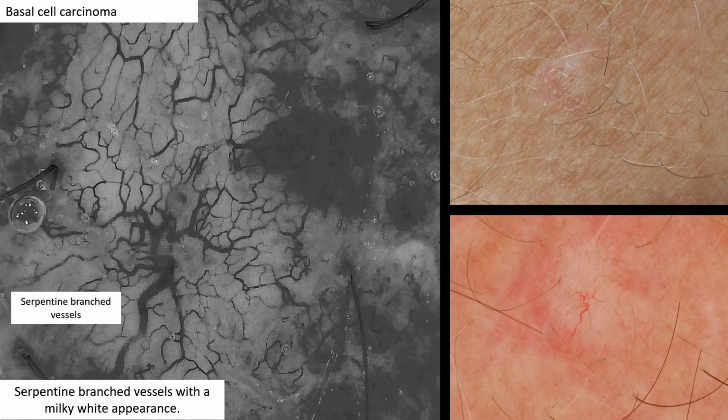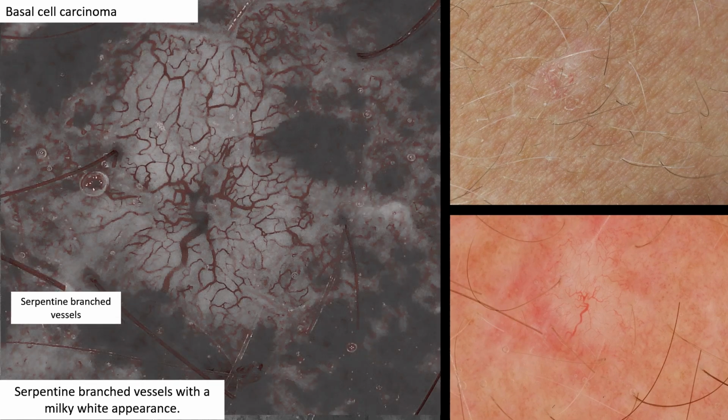In this case, clinically a whitish papule. Dermoscopically, we have one serpentine branch vessel with these milky white areas. In the ultraviolet light mode, we see these thick serpentine branch vessels. These are actually enhanced with the vascular enhancer. It's a beautiful case demonstrating this basal cell carcinoma.